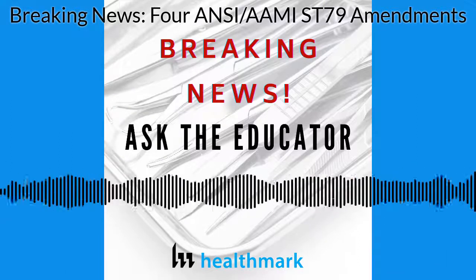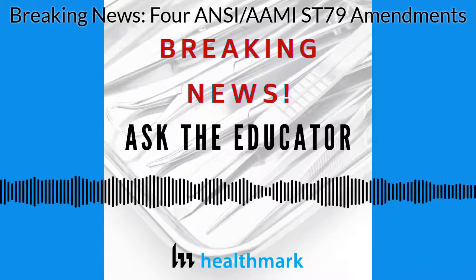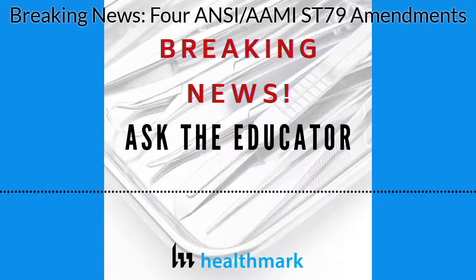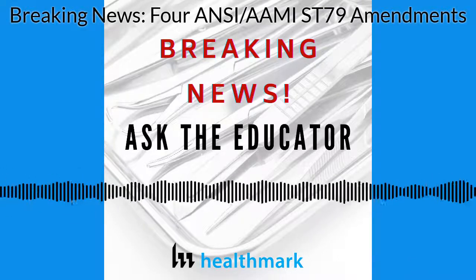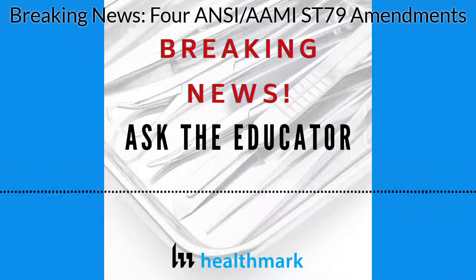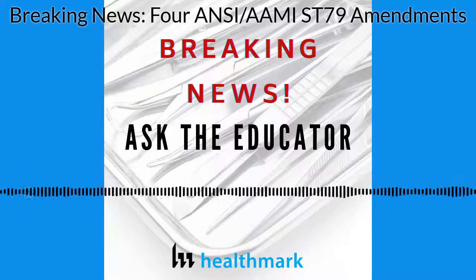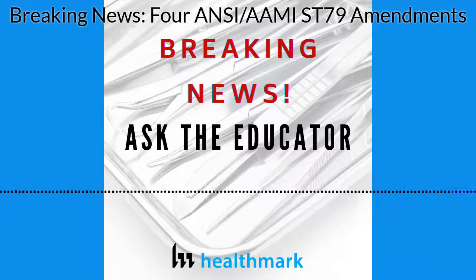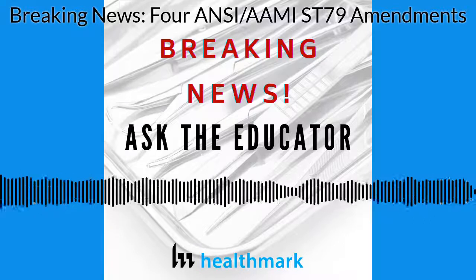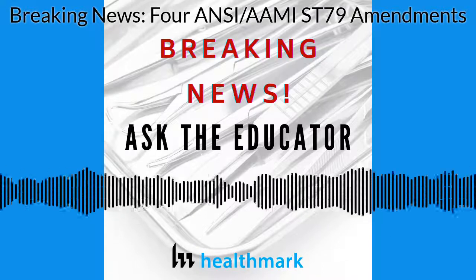And one thing that jumped out at me was the statement that dust mops and brooms should not be used for cleaning procedures in the sterile processing areas. Damp mops should be used instead to clean the floors, which aligns more with how the operating rooms are cleaned. And another interesting point was how the use of cleaning verification may be used to monitor effectiveness of environmental cleaning procedures. So let's look at amendment number 2, which has 2 new sections, 8.2 and 8.2.1.